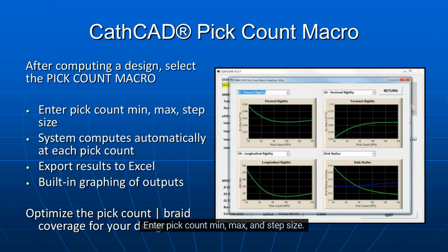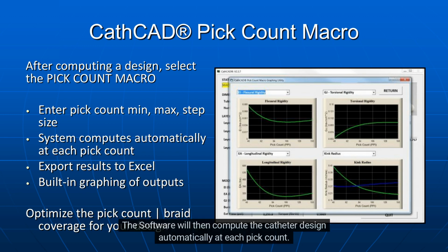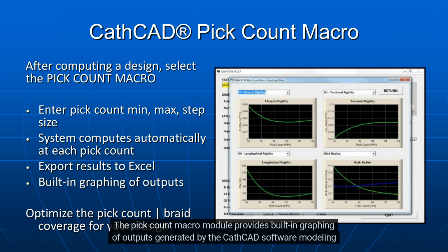Enter pick count min, max, and step size. Next, the user shall select the OK button to execute the pick count macro. The software will then compute the catheter design automatically at each pick count. The results from each pick count execution is exported directly to Microsoft Excel. The pick count macro module provides built-in graphing of outputs generated by the CathCAD software modeling engine.